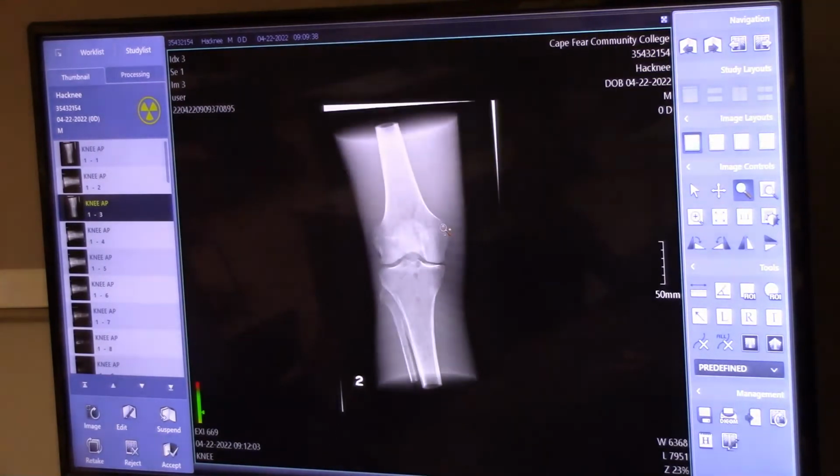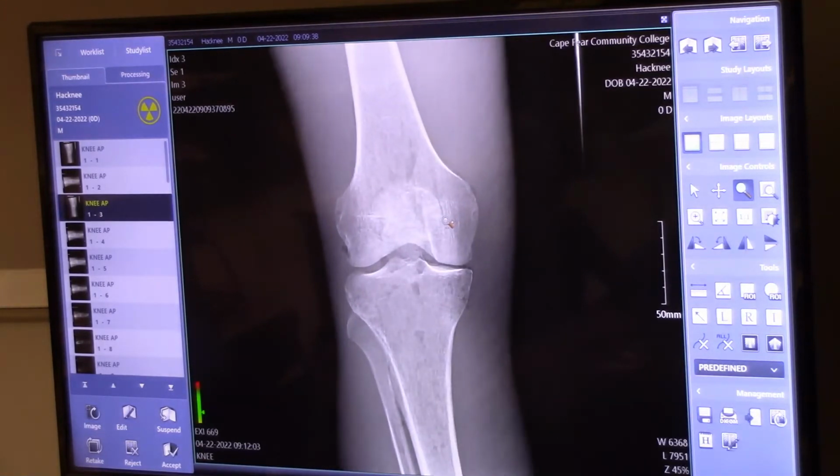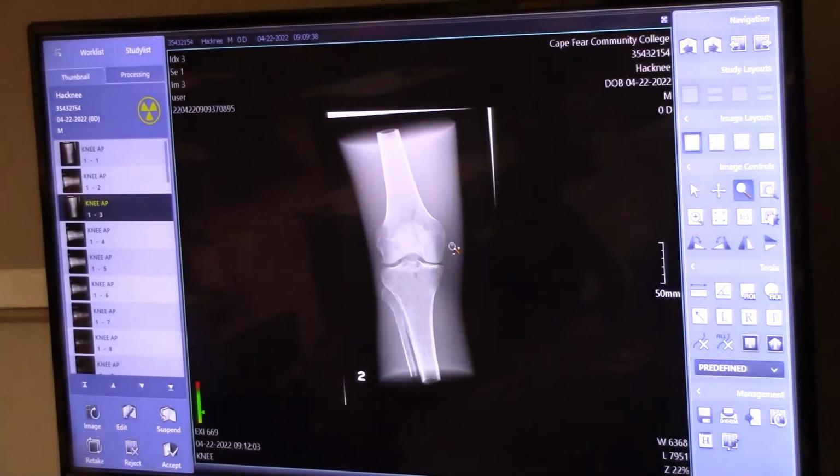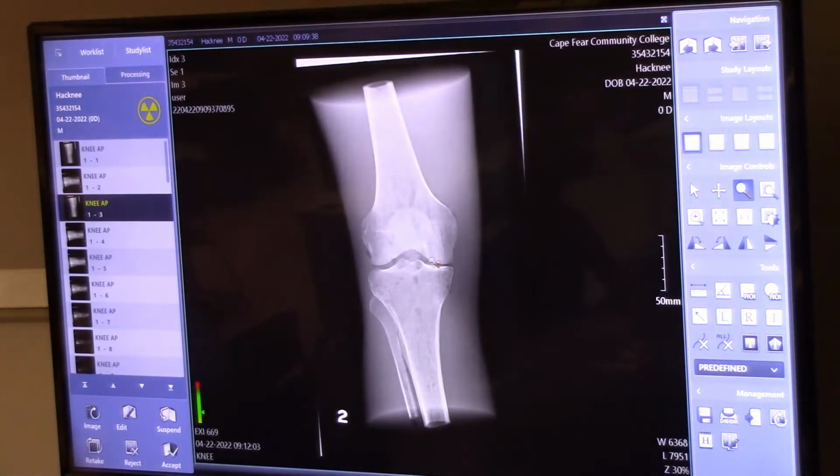But how does the image look besides the moire? It looks okay. I kind of tend to agree. I think that looks all right. Would I pass that? Well, I'm not real happy about it, but I'm going to do it because I can see everything I need to. I'm just going to give the next image a little more energy because that was a low exposure index.